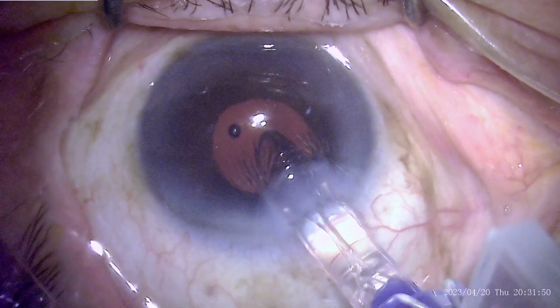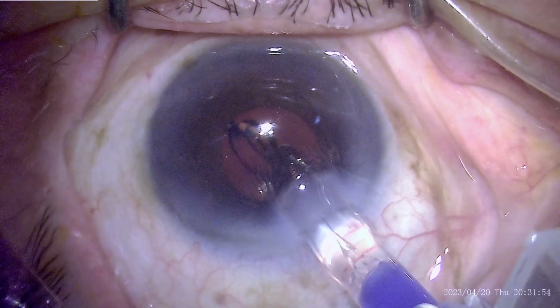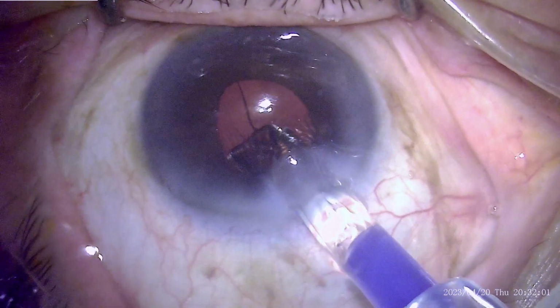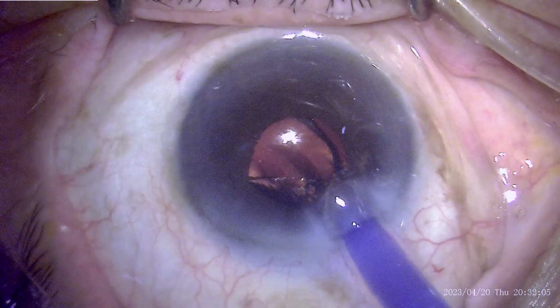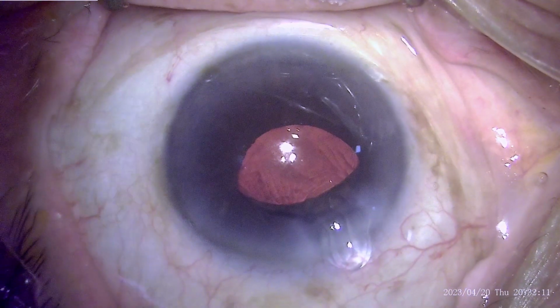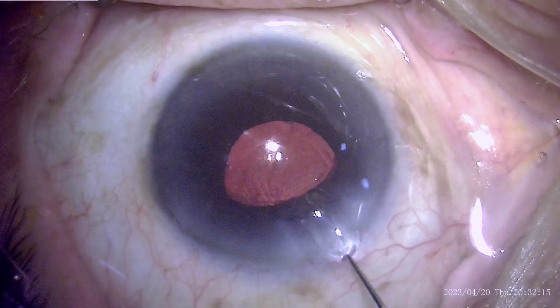Probably that is why the company had provided a thicker tip so as not to break the IOL, but in a gradual and very controlled fashion I was able to inject this 26 diopter IOL using a standard 2.8 mm disposable cartridge. The trick is being slow and deliberate and allowing the IOL to get deformed so that there is no breakage of the optic or the haptic part.